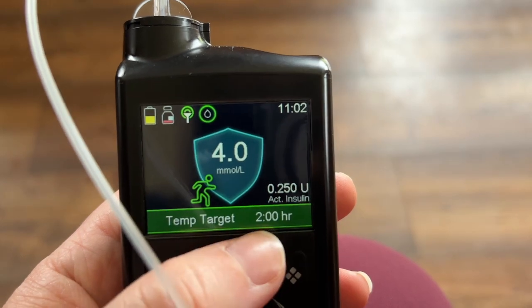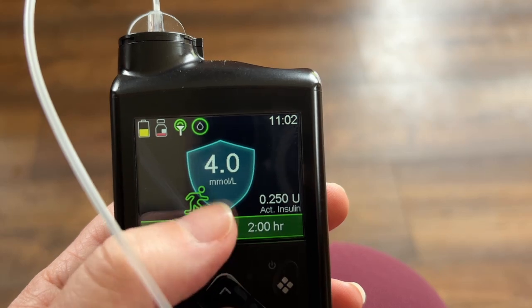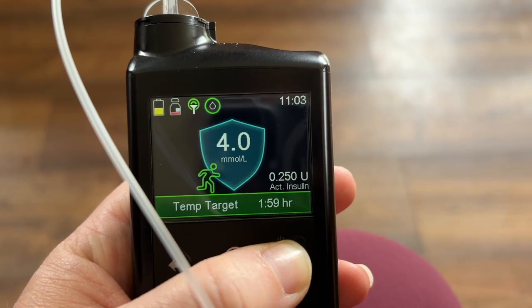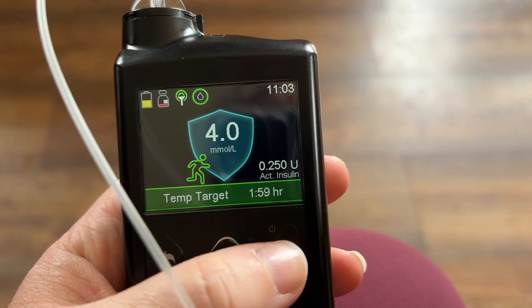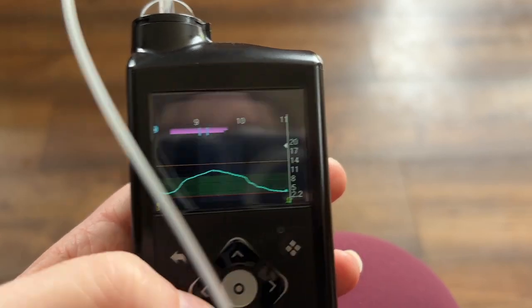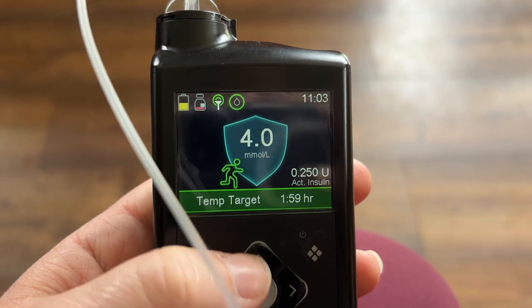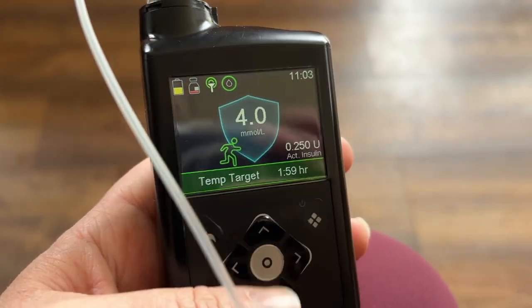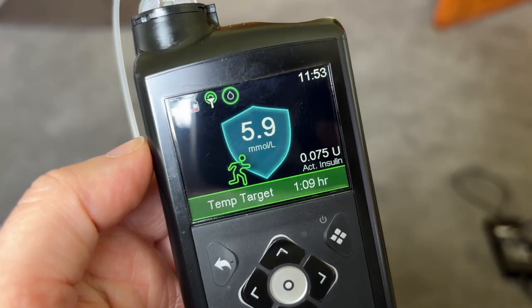A little banner comes up along the bottom and it will start to count down. If you decide you don't want to go for a walk you could just cancel the temp target. My blood sugar is 4 — I'm hoping by 12 o'clock, with the two-hour temp target, it will start to raise my blood sugar towards the 8.3 target. If not, I'll have a little snack before I go walking. I'll catch up with you in an hour — that's how you set the temp target on the Medtronic 780G.